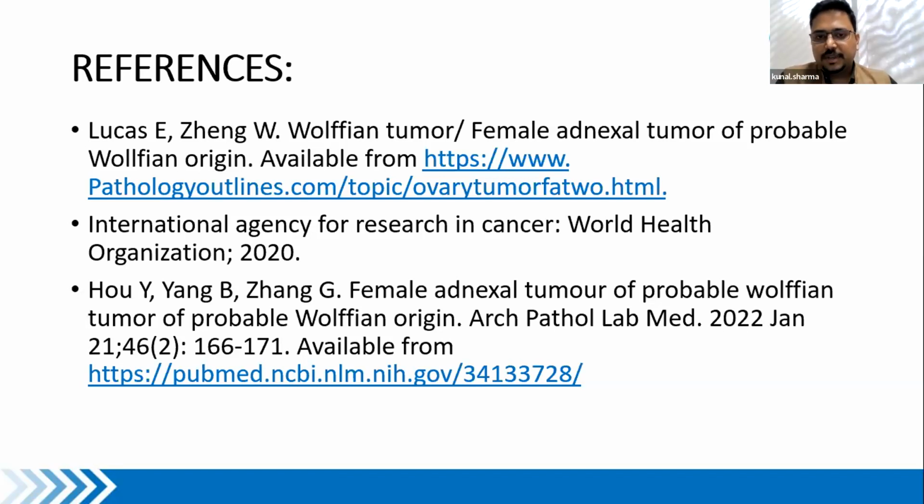It also makes us aware of this entity, especially when we, as Sunita ma'am had said, ESS with glandular elements is something that can look quite like this. So we need to understand that there is an entity like this, which we need to very carefully rule out. With that, I think we can proceed to our next case.